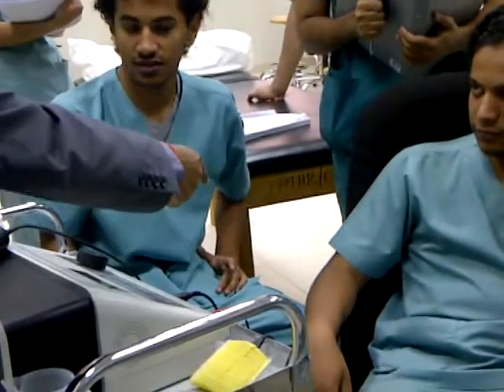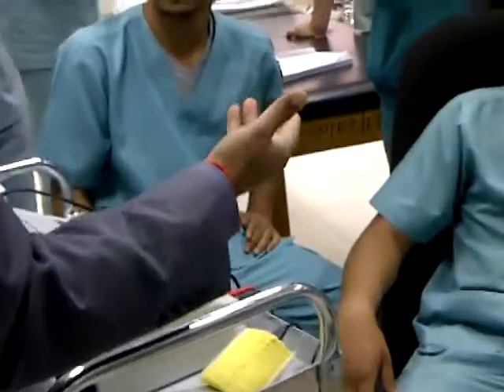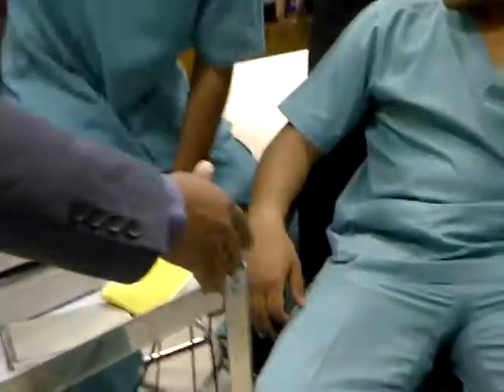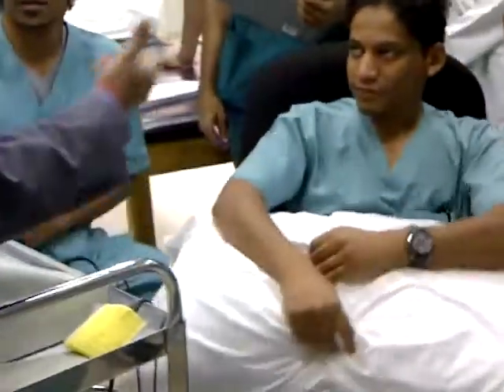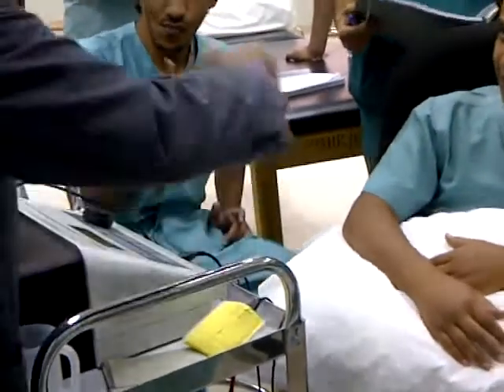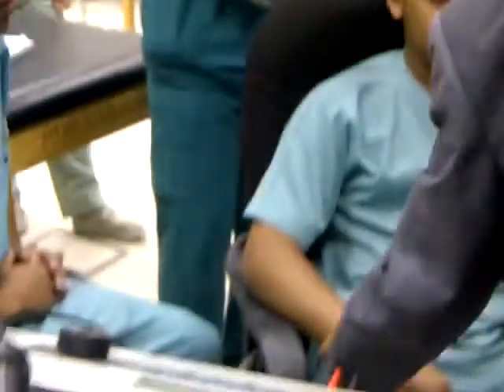In this position also, I feel the patient may not be comfortable. To make him more comfortable, you can put one or two pillows down. If he is comfortable with one, leave it. If not, try to give one more pillow. Why is he more relaxed? Because I am decreasing the distance between the shoulder and the armrest. Here, there is more dragging. If you give some support, it becomes much more relaxed.